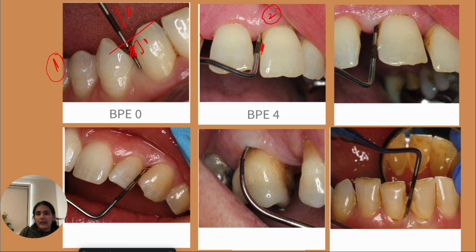So, one marking we can see, the other marking we see partially. So when it is partial, it means it is lying between 3.5 to 5.5. So 3. Yes, partially visible. 3.5 to 5.5 means it's score number 3. So that's how you score it. Okay. Now next one. If you want, I can zoom it for you.